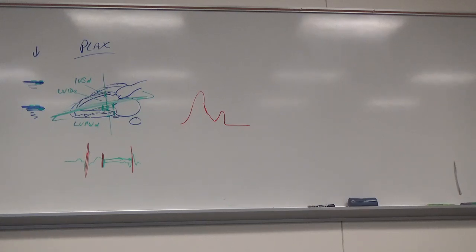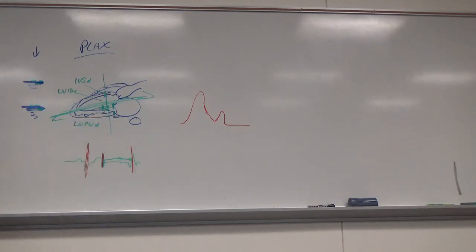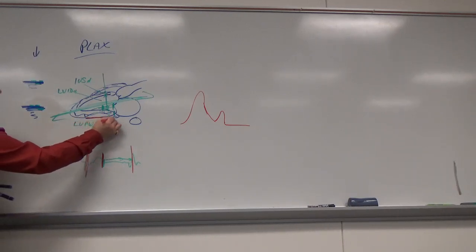So we're doing the outside wall just to the inside of the ventricle? I guess so. Here you're measuring right there, just on that leading edge to the leading edge of this wall, just before the really thick pericardial line that you're going to see back here.